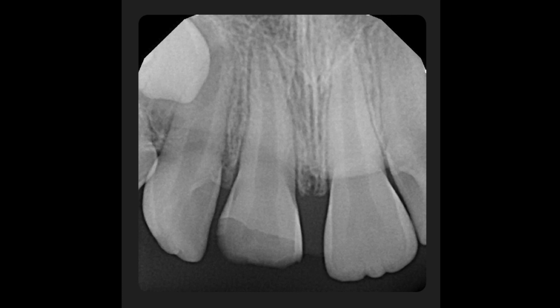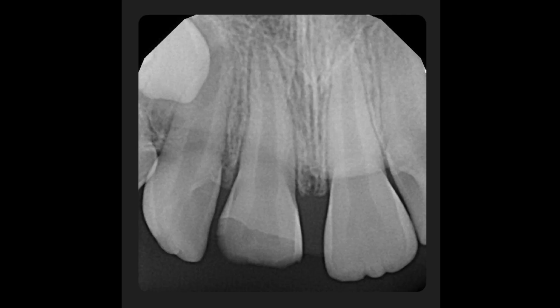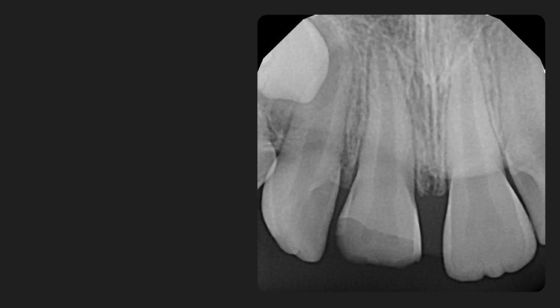There were no signs of any spontaneous pain or anything that would suggest pulpal necrosis. However, what was interesting on the x-ray is that the apex is open — it's an immature root. We can clearly see that a large piece of the crown has been broken. This becomes very challenging to manage, especially since we have a vital pulp in there. We need to really preserve that tissue to further promote the natural maturation of the root in terms of length and width.